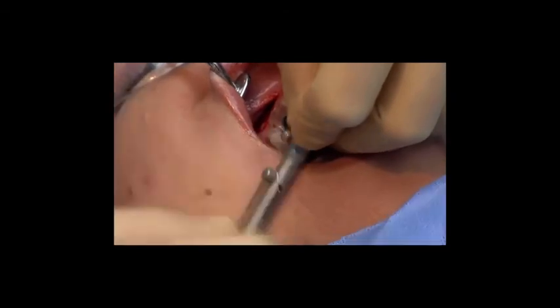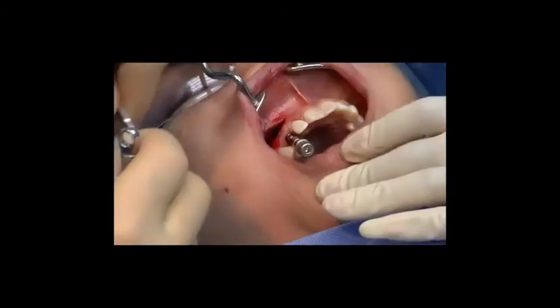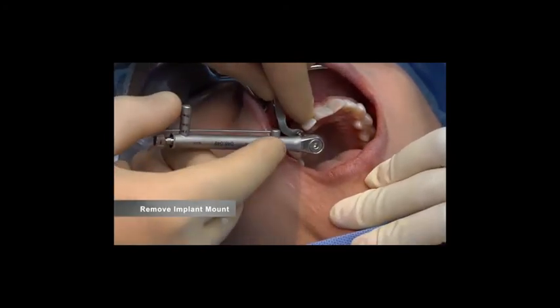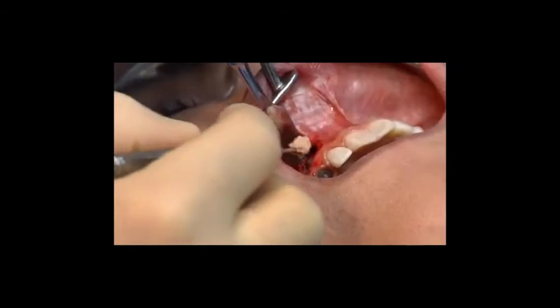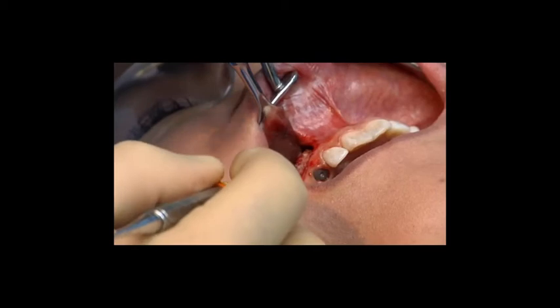Typically, I like to place these with a hand ratchet. A lot of other people like to use the handpiece. That's just personal preference. These are the old style mounts that still had to be taken off. The guided mounts nowadays, this is not necessary anymore because now we can use the universal Loxim mount with guided drivers so that this does not have to be removed. But with this old type of mounts, we had to remove them, which is not a big deal as well. So this is the removal of that mount, and you can see now the implant has been placed at the correct depth, and we place a healing cap over the implant, and then we do the bone grafting.